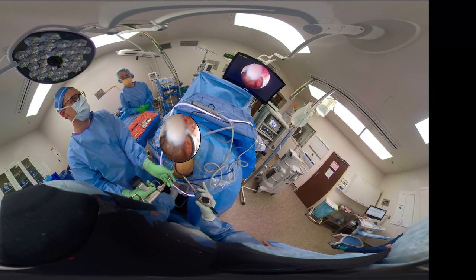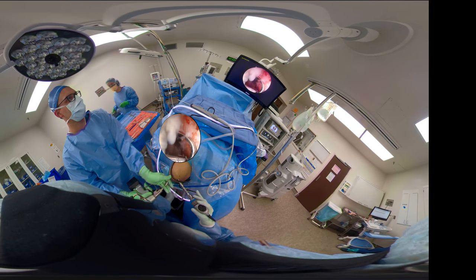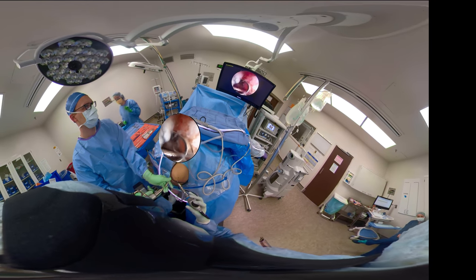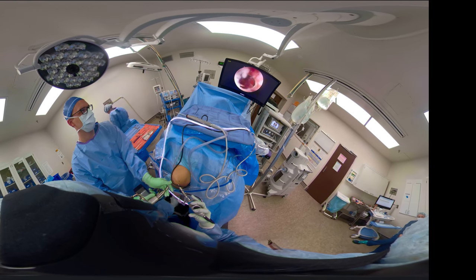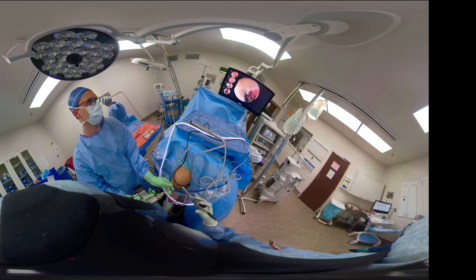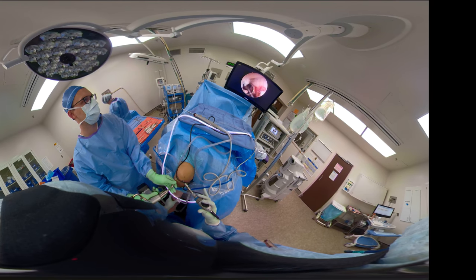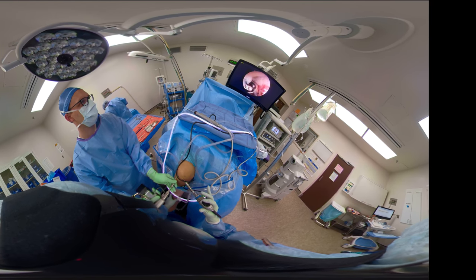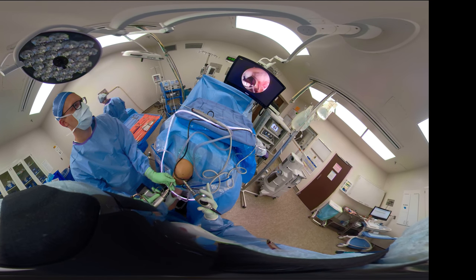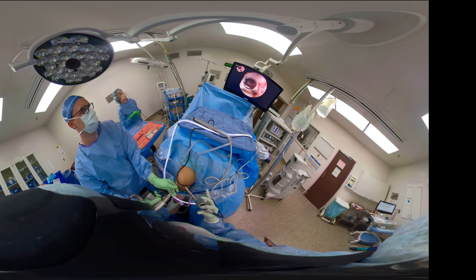And you can see where there's good bleeding from these 4-5 drill holes that we've made. I haven't turned the water off at this point. And you can see on the all inside how good the bleeding is with these good globules of bone marrow and blood coming out of the microfracture holes. So we're happy with that. So in this defect that's 2 by 1 centimeter, we're hopeful that with the microfracture technique, he will fill in with not a normal surface of articular cartilage collagen, but a better surface than the defect of the pothole, so to speak.